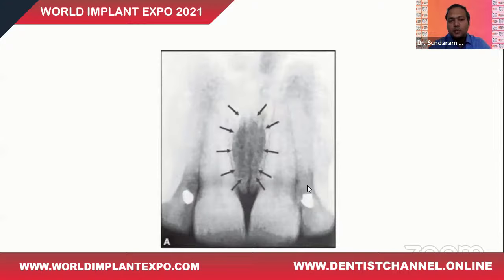Now, what is this structure? This is the incisive papilla region of the upper incisors. It is present between the upper incisors. For instance, if one of the incisors is missing and I need to plan an implant in this region, I'm equally concerned about the contents of the incisive canal. So my space for the implant is only going to be limited up till here, and not up till here.